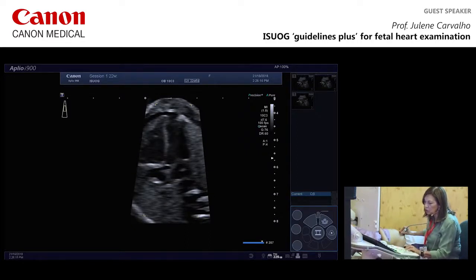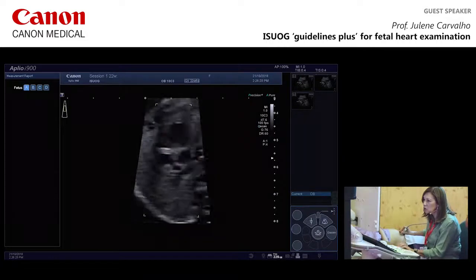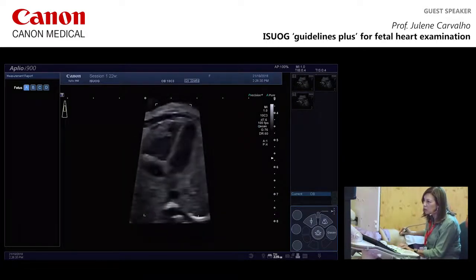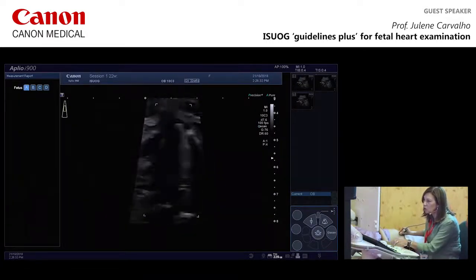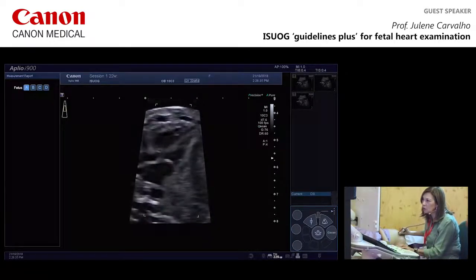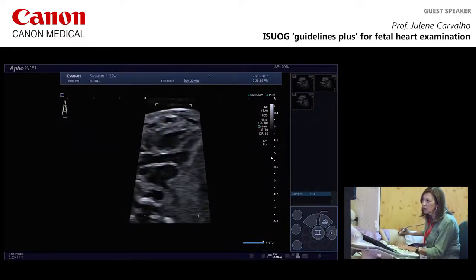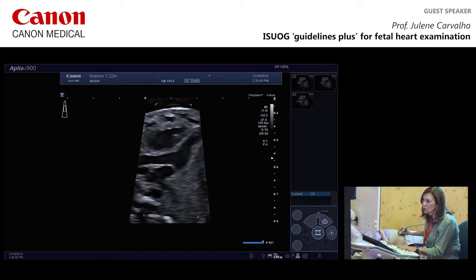So if you're going to measure, ideally you measure more in a different plane, but roughly here. That is obviously incorrect. You have to question that. 2.6, a little bit small for 22 weeks gestation, because I'm not in the best plane. So it's no good doing it when you don't have a good view. Baby's cooperating now, getting the left ventricular outflow tract. Much better here. So stop, freeze, and move the transducer, and then go back slowly, frame by frame.